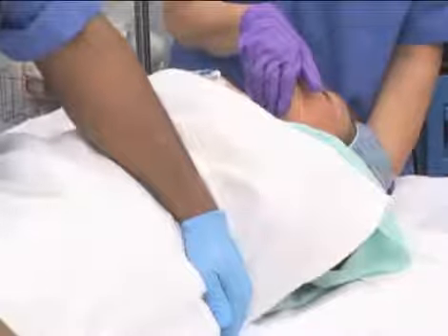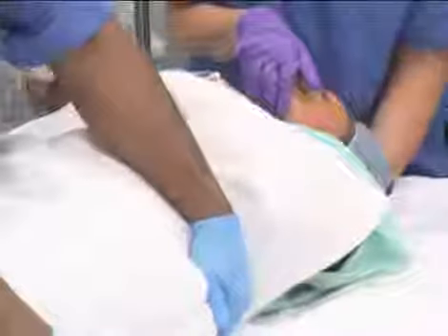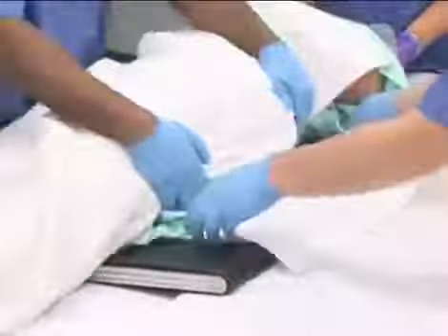To use a transfer board, you will need to log roll the patient. 2 to 3 people stand at the patient's side and grasp the opposite edge of the bed sheet or draw sheet. The edge of the draw sheet is pulled toward the assistants to log roll the patient into a position on his or her side with the front of his or her body facing the assistants.